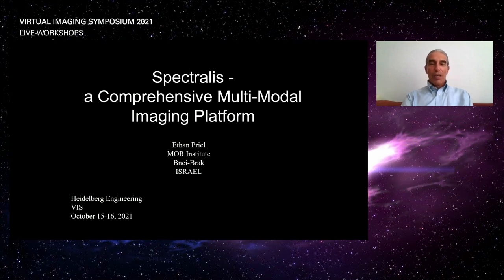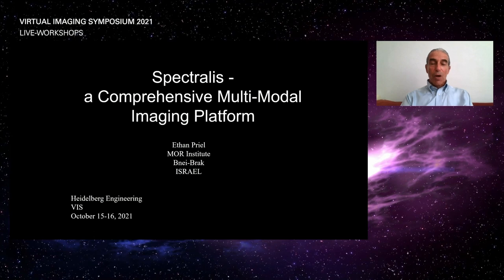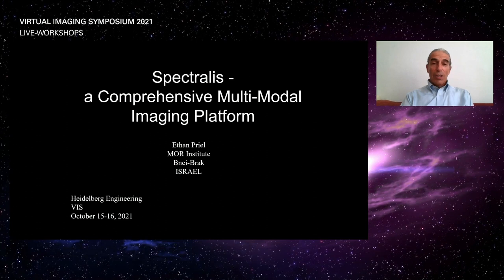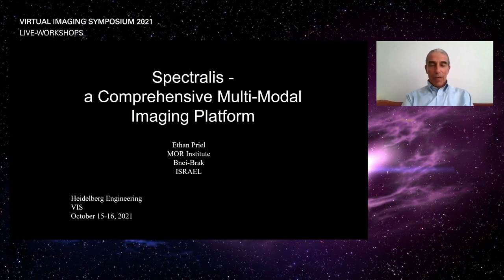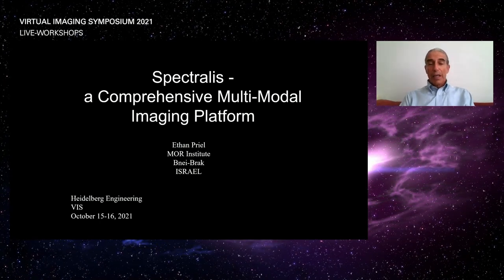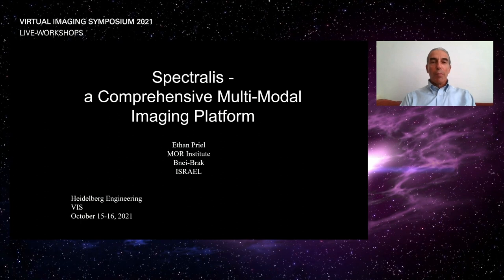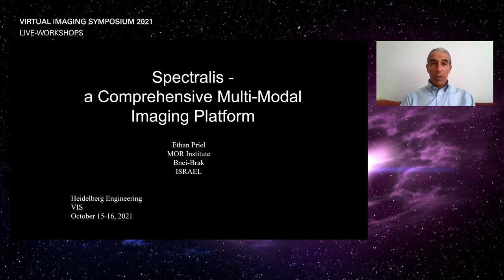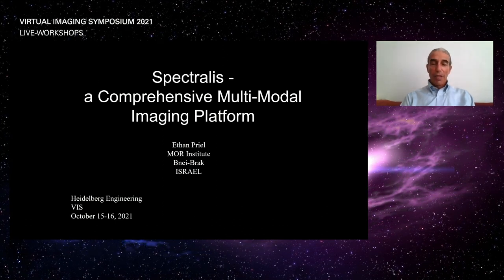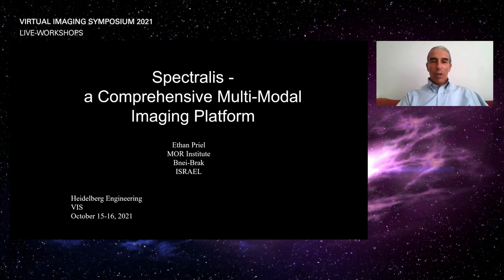And you know, with the years of doing these various applications comes some perspective. We started many, many years ago using film, graduating to digital. Once digital arrived, ICG was available. And rapidly after that, in the early 90s, confocal scanning laser ophthalmoscopy arrived with the Heidelberg and other instruments, and that enabled the first truly multimodal imaging platform, if you will. We were able to do both fluorescein and ICG together through the same lens at the same time.